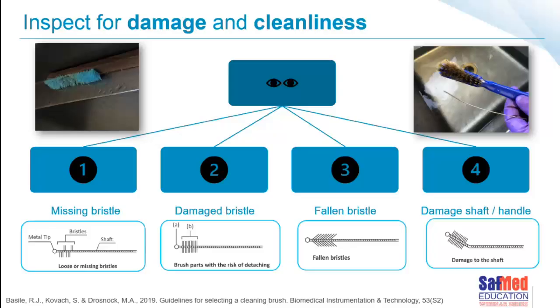If our brushes are not in good nick, we are not going to clean effectively. We may damage the instrument. We can even leave a bristle in an instrument, in a device, in a lumen, that could be a foreign body that can cause a huge infection for a patient.